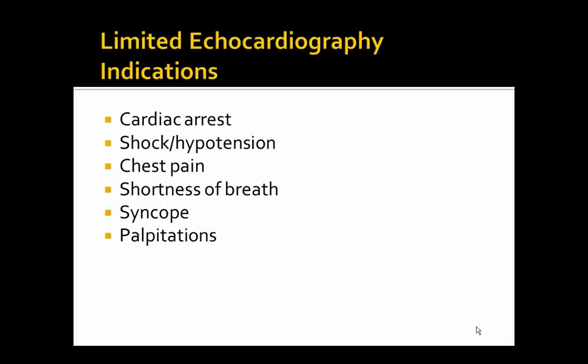So, indications. We're talking about mostly you students on a third year clerkship, but later on in your practice, I want you to think about reasons you might do this, and then I'll talk about when to do it on a clerkship. You may do a limited bedside echocardiogram in somebody in cardiac arrest, someone who's got signs of shock or hypotension, maybe someone with chest pain, shortness of breath, somebody with syncope or lightheadedness, dizziness, or maybe with palpitations. Some of these depend on your clinical scenario and what your differential diagnosis is, but in many of these cases, a limited bedside echocardiogram can give you extra information and again help you make a better differential, make a better decision, better plan.